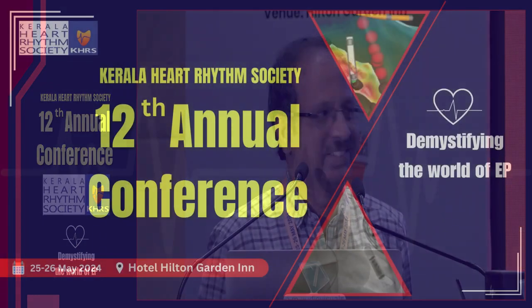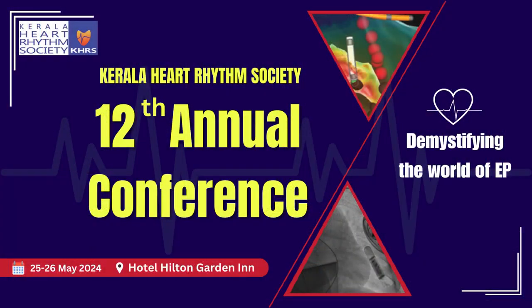You don't have risk of phrenic nerve problem on the left side at all? No, it is not a complication on the left side. And you do both the stimulation in the SVC-RA junction and keep looking for diaphragmatic pacing. Yeah, and also do the action potential monitoring? We do all of them. But generally monitoring alone would be sufficient. But we monitor as a standard protocol, we take all these things.